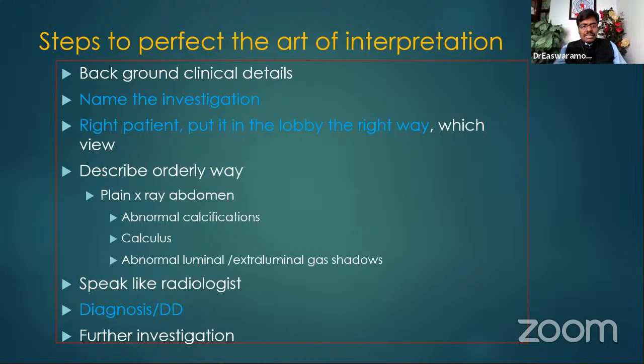He was in emergency. He had a CT scan done. You do a CT scan. The CT scan might show an incidental renal cyst, or even, if it is a lady, a 4 centimeter ovarian cyst. But you should not jump into whatever is striking you. You should go by the background information provided, look in the appropriate area, exclude the main diagnosis, and then these bystanders are additional diagnoses.